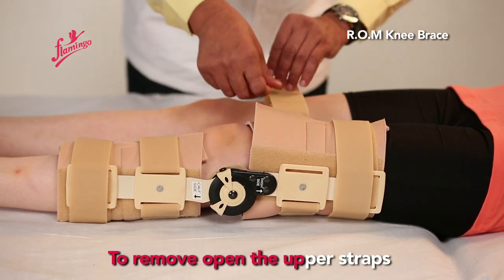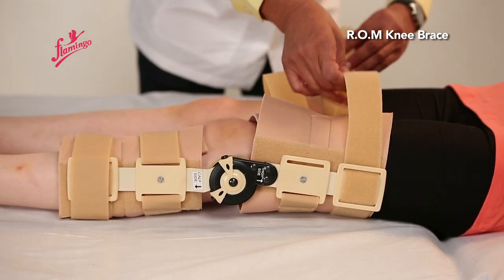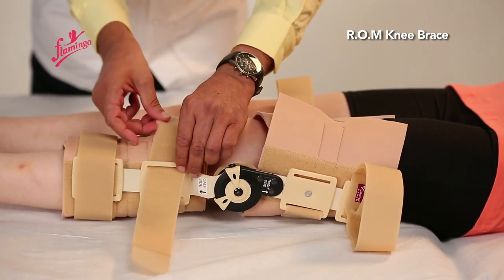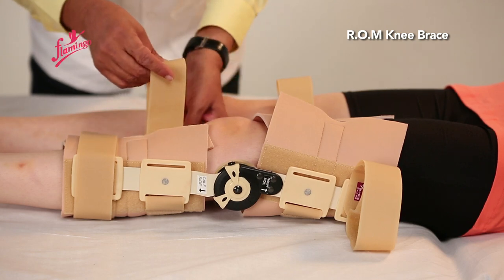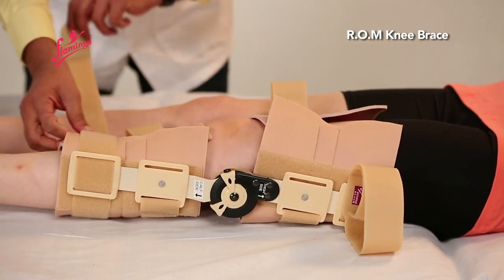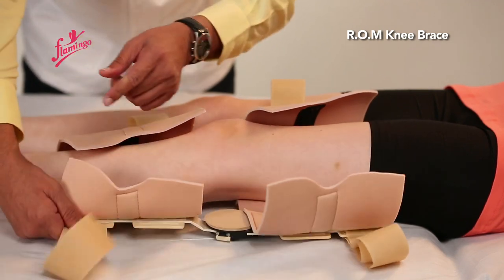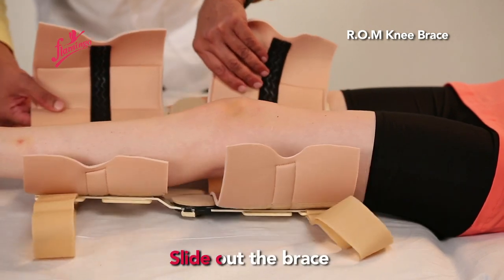To remove, open the upper straps, followed by the lower straps. Slide out the brace.